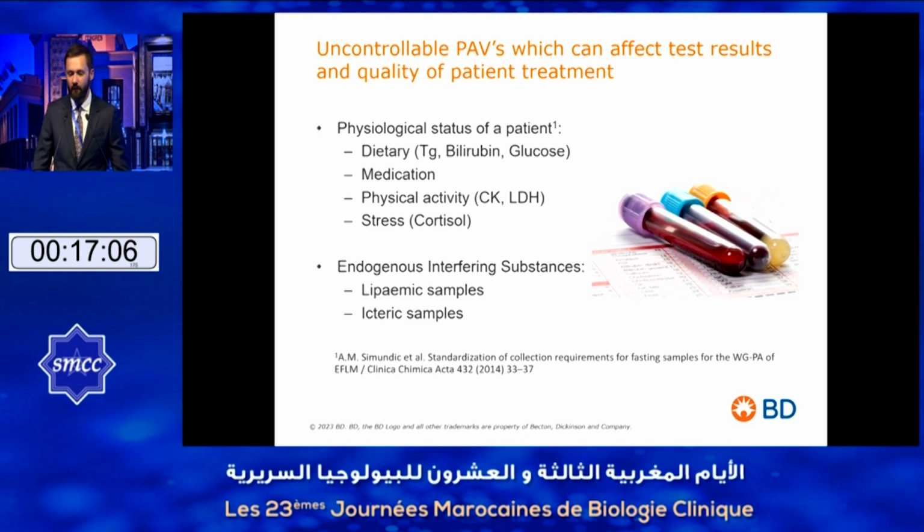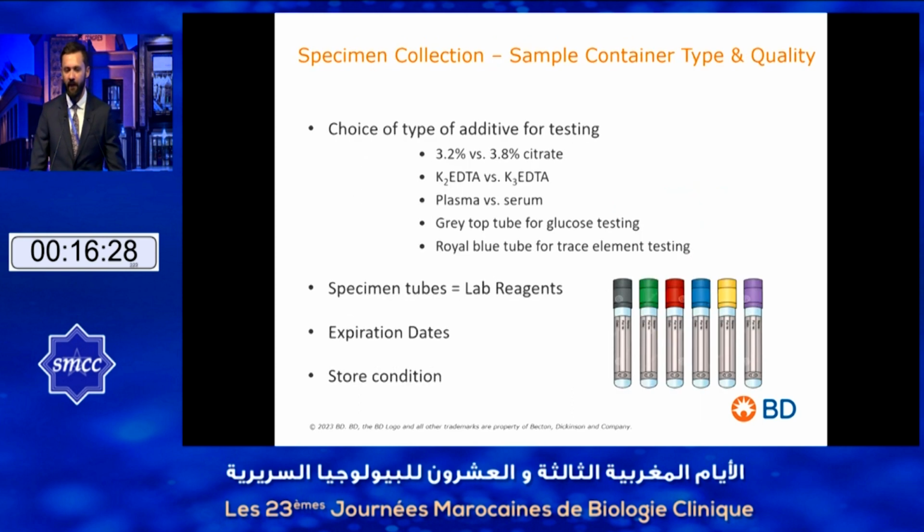So first of all, when we treat a patient in the phlebotomy room to collect blood, we always ask if the patient is well prepared for lab tests. And what do we recommend to our patients for how to get ready? First of all, fasting at least 12 hours before specimen collection. To avoid smoking, to avoid drinks, and definitely to inform our blood collection staff, nurse or phlebotomist, if the patient takes any medicine. So these are very simple rules. Also avoid any strong physical activity 24 hours before blood collection. Otherwise, the quality of the blood test might be affected.